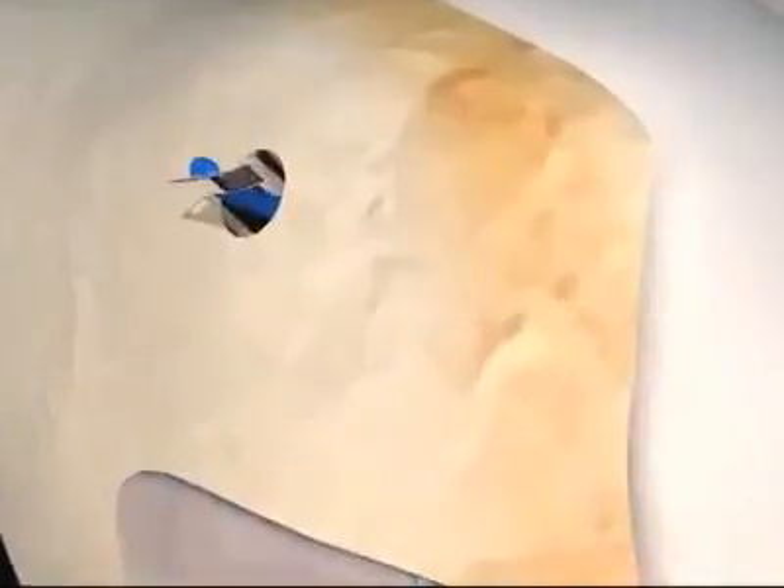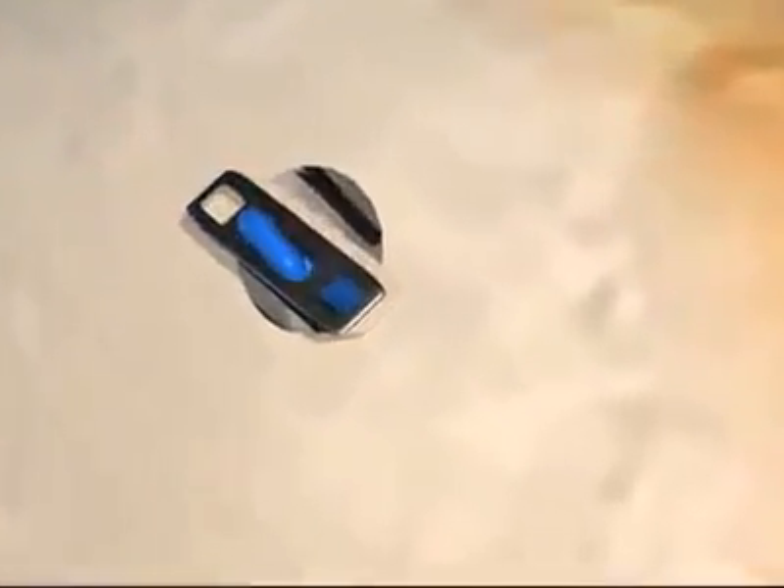A small grappling hook will anchor the upper end of the graft and a screw will stabilize the lower end. The screw is usually bioabsorbable, meaning your body will incorporate it into the bone over time.